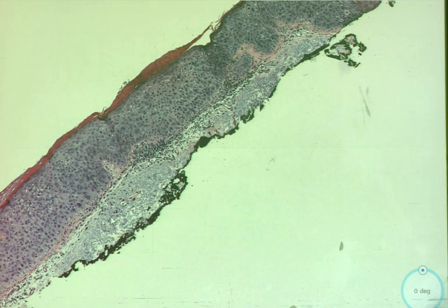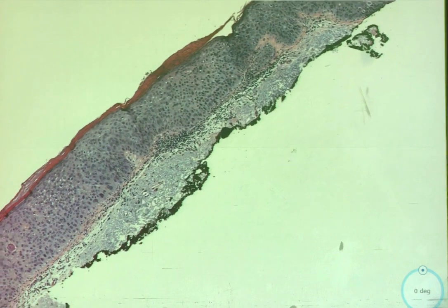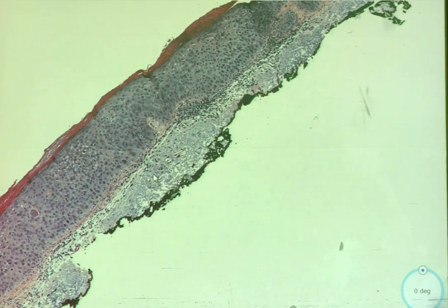And so when you have it at the ink, on these small biopsies, which you can imagine, they do a very small biopsy of a huge area, it's not unusual to have atypia or carcinoma present at the ink. What you would say in your note is something like, we cannot rule out invasive carcinoma, because we have carcinoma at the base. It doesn't look invasive there, but we can't say it's not.